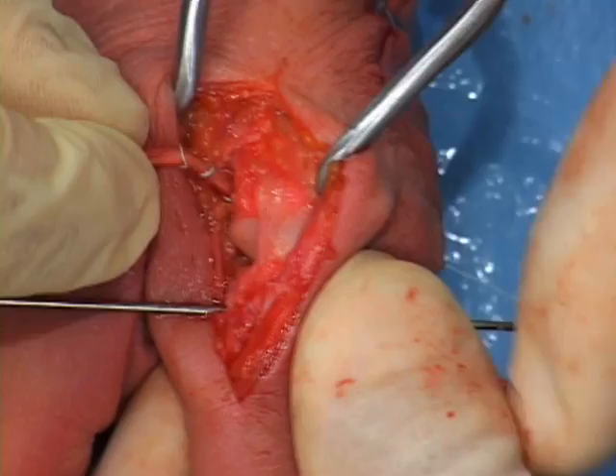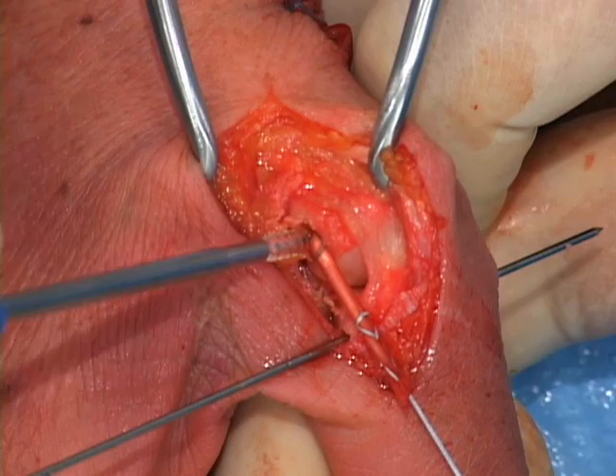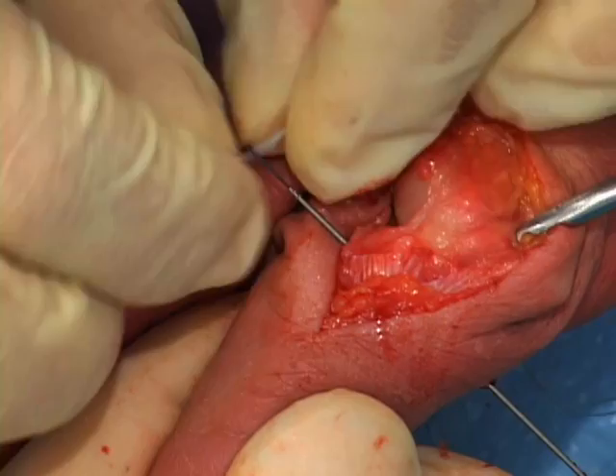The wire is withdrawn radially out of the metacarpal, pulling the whip-stitched graft into the drill hole. A 3x8 mm biotenidesis screw is advanced into the drill hole, locking the tendon in place. The screw should be proximal to the tendon in the socket.